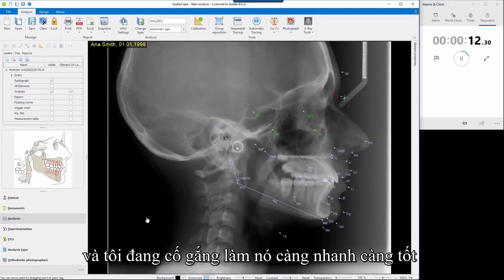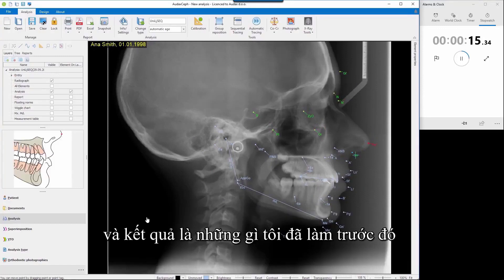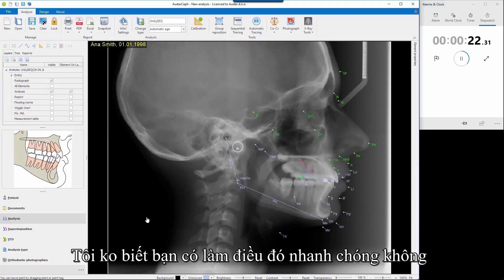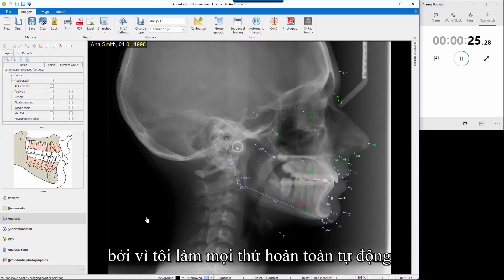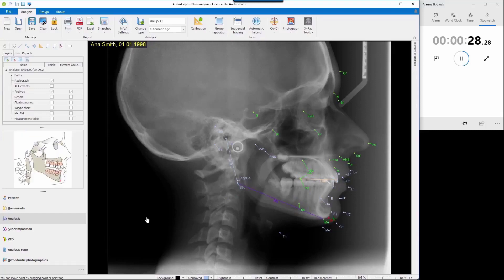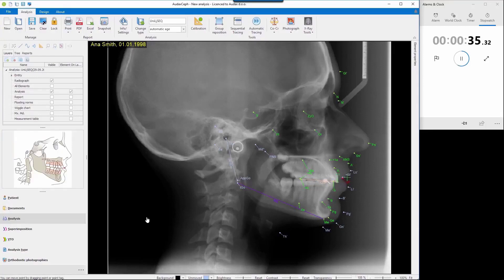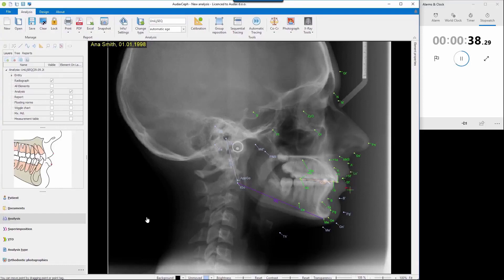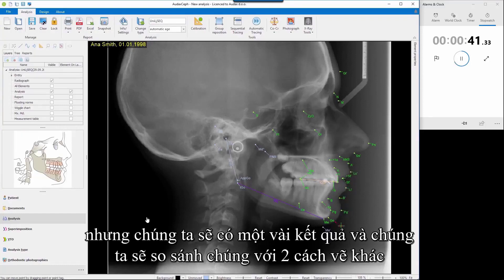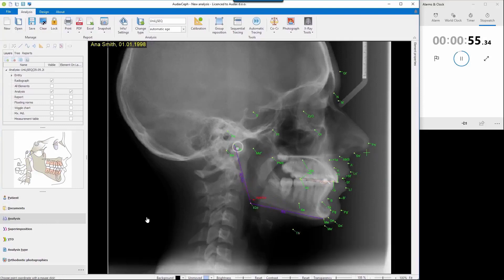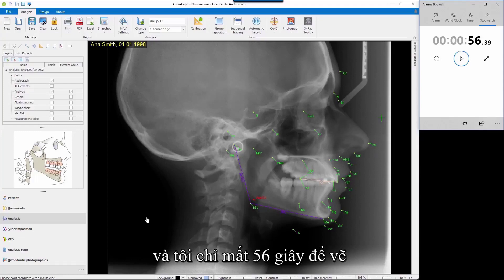I started the stopwatch at the beginning and now I'm doing the tracing. I'm going through this very quickly because I've done it several times before and I'm trying to do it as fast as possible. That result is something I've done before, which is why I'm really quick. I don't know whether you can do it as quickly, but we'll compare the results to the other two tracing methods. I have 56 seconds.